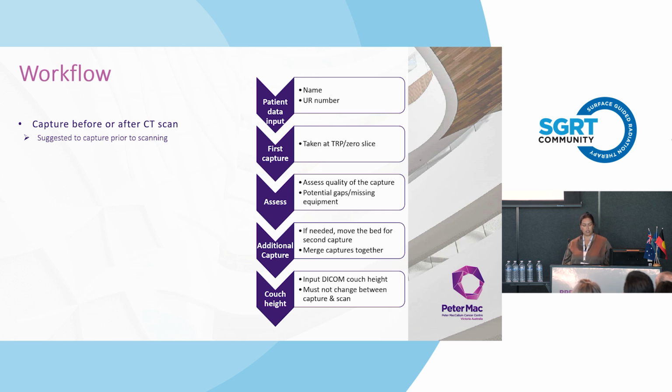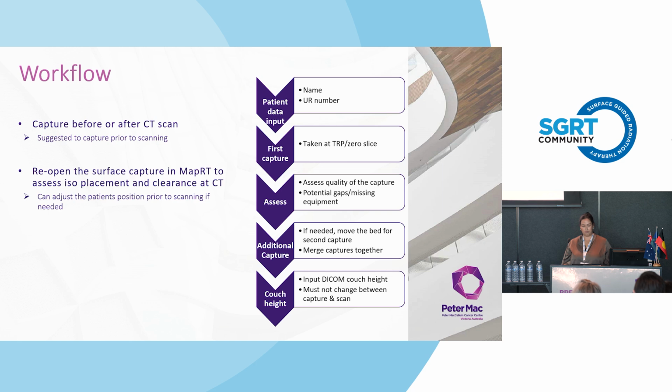So it's a pretty quick process, and that capture can be taken either immediately before or just after the CT scan. It was suggested to us to take the capture prior to scanning during our vendor training. That's because the surface capture can then be reopened in the MapRT browser to assess potential isocenter placement and gantry clearance whilst in the CT room itself, to then allow for any adjustments to the patient's position prior to scanning.